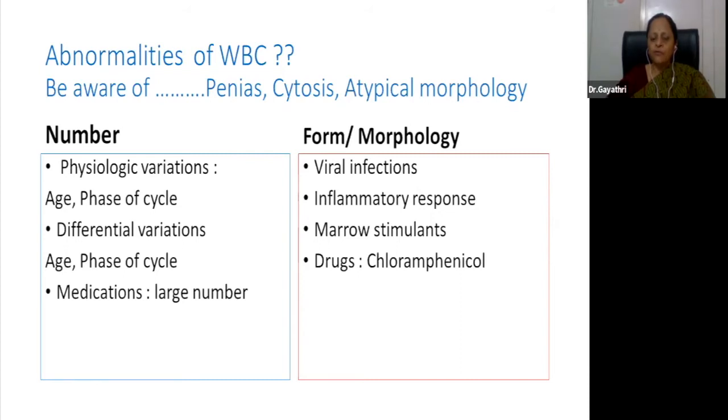So it is very important to be aware of physiologic variations so that we do not make the mistake of calling a normal variation an abnormal one. So the first fundamental thing before we study abnormalities is to know what is normal and what are the variations that one can expect. We know that histology is the basis of good histopathology.